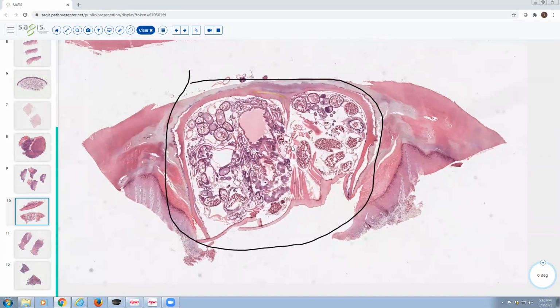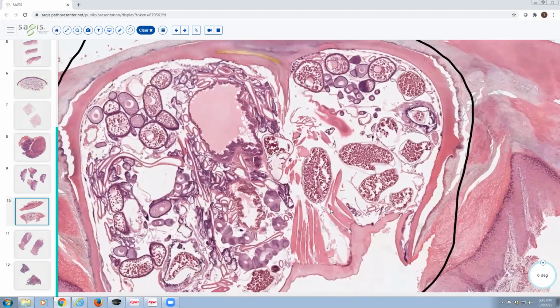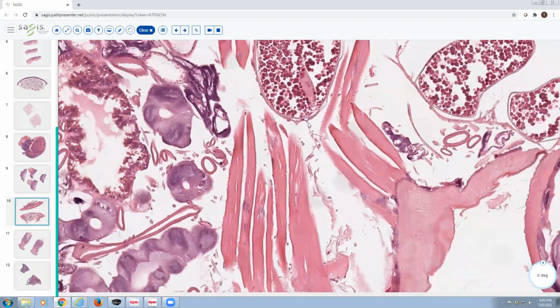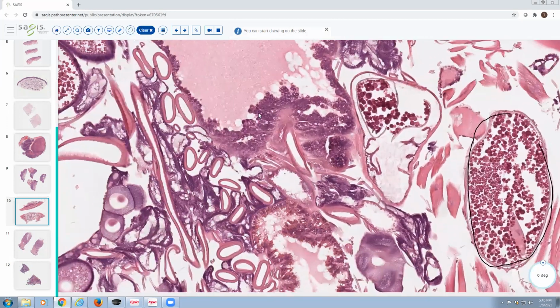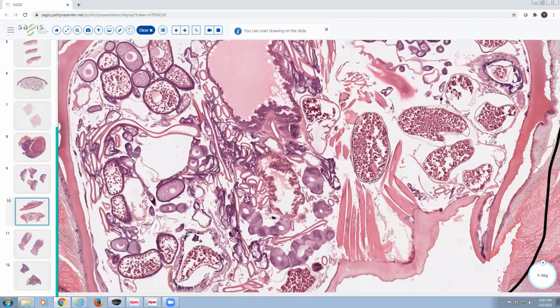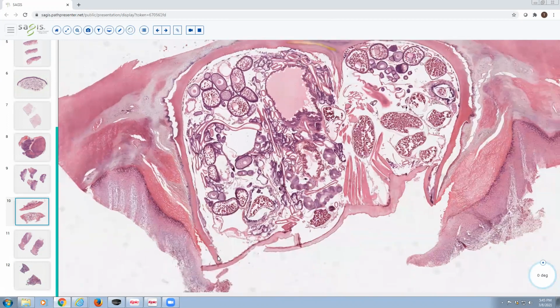Looking at the flea a little bit more closely, you're going to see all the anatomical structures that you would expect to find within an animal. So it's going to have muscle. Here's skeletal muscle bundles. You can see the little striations there. It has a gut, which is filled with blood in this case. It's these things here. There's respiratory epithelium. And you've got this chitinous exoskeleton. So the exoskeleton has this smooth pink profile. It's like a shell.